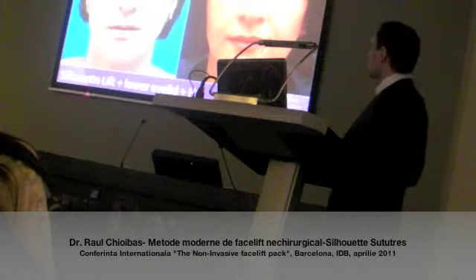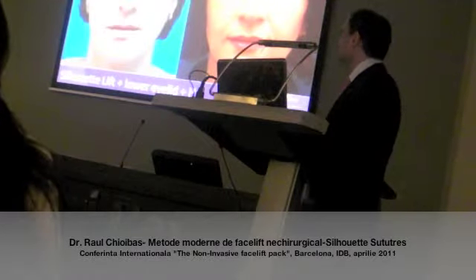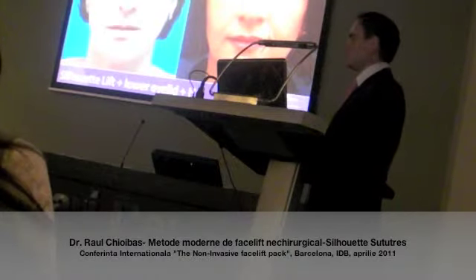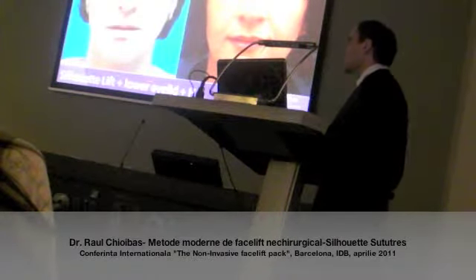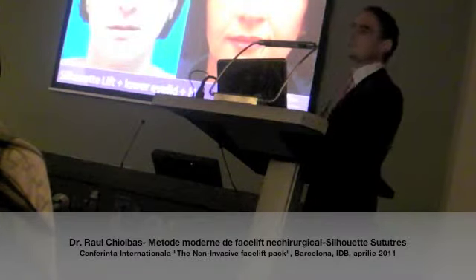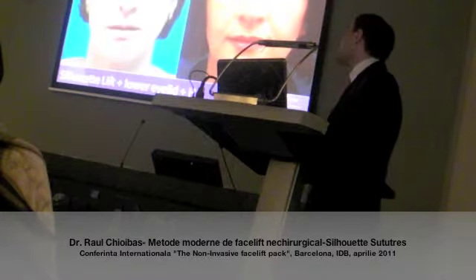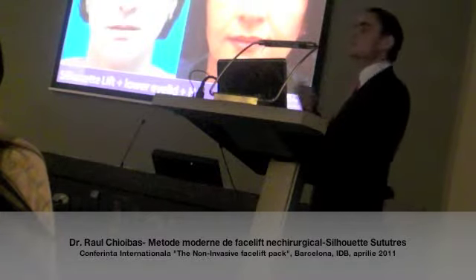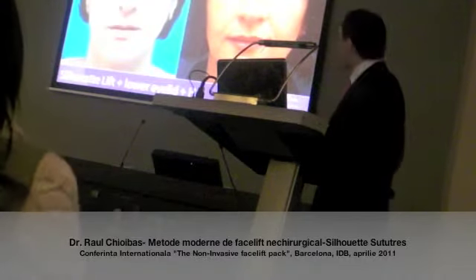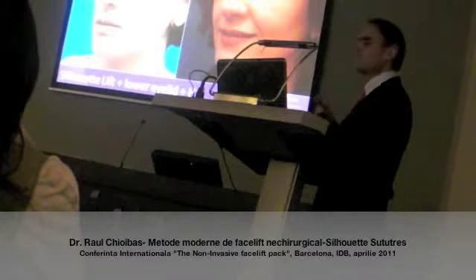This is another case where we did. You see, this is what I was discussing with the colleagues today. We usually combine. Silhouette lift is a tremendously good technique, but we feel that if you combine it with adjunctive techniques, like lower lid, like a little bit of volume enhancement, it could be a magnificent result. And this is what we feel that we can get, at least when the patient is coming in, she's smiling. And this is already something that gives you the thing that you need to go for.